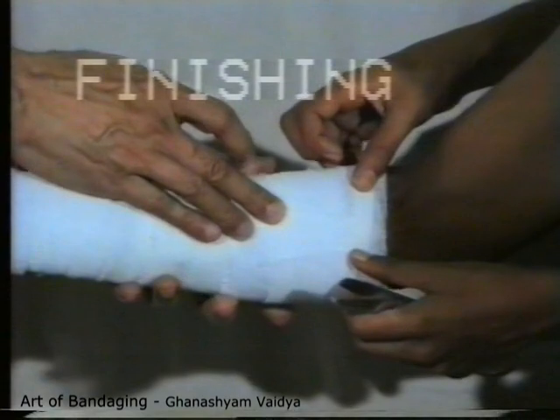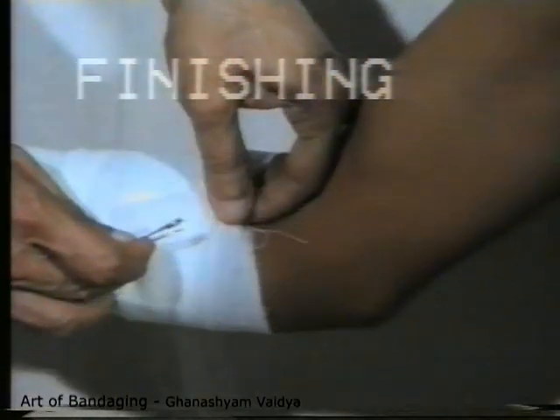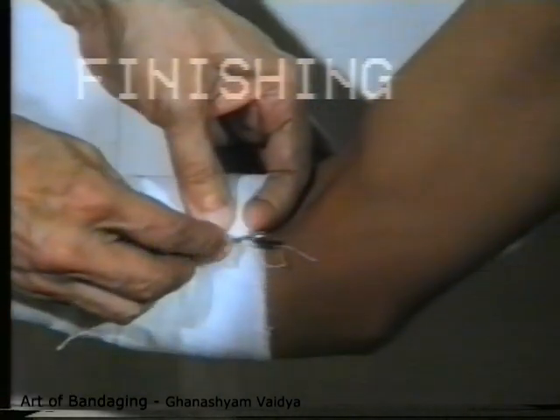Use only as much bandage as is necessary to serve the purpose; do not try to finish off the roll otherwise the bandage will become too bulky. Lastly, fix the end with strips of sticking plaster, safety pin, or by splitting the end and tying two thin strips. Adhesive plaster two inch long are fixed over the end of the bandage; a 6 inch bandage may require three strips. Folding the end of the bandage also makes removal easy. To tail the bandage, split the terminal portion longitudinally, take one simple knot to fix the tails to each other, and then tie the tails around the limb. If the dressing is wet or likely to be soaked with discharges, the adhesive strips will not stick, so it is better to fix it by tailing. A safety pin may be applied to the end of the bandage, lifting the bandage up to protect the skin.